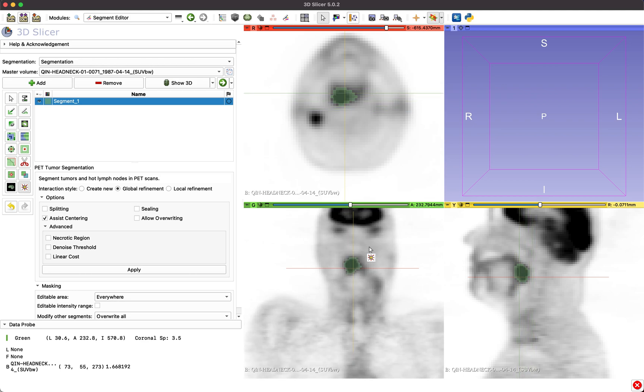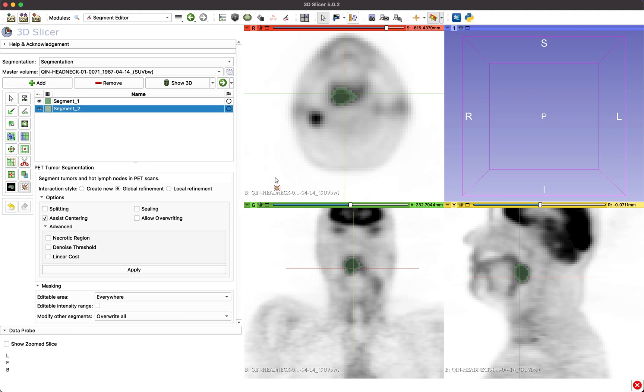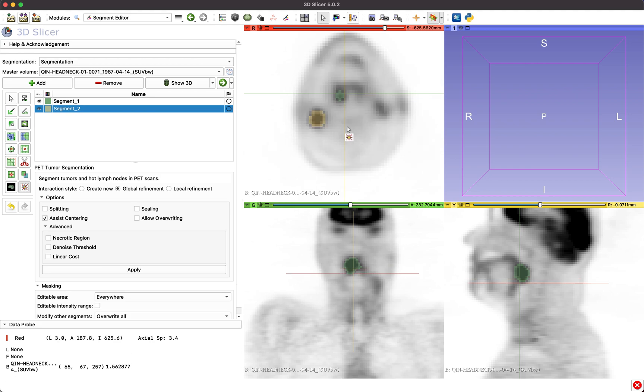To add another lesion, add a new segment and start with the segmentation process. In many cases, just one click is sufficient to obtain a good quality segmentation for each lesion.